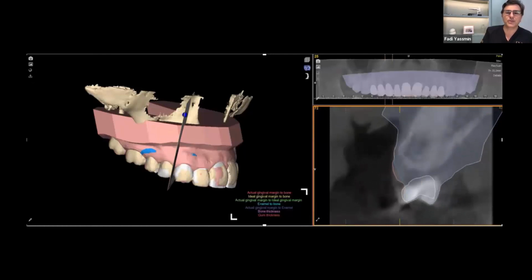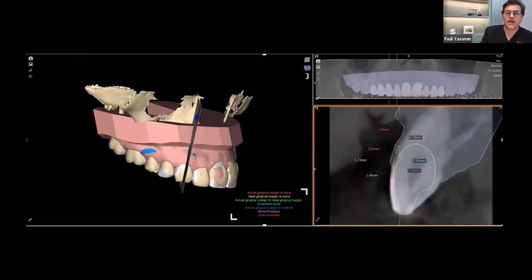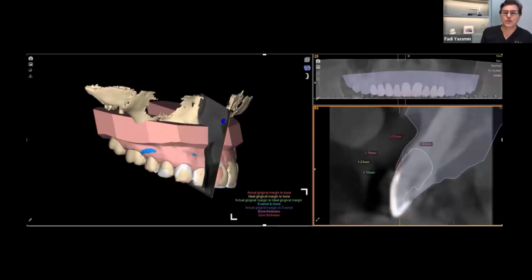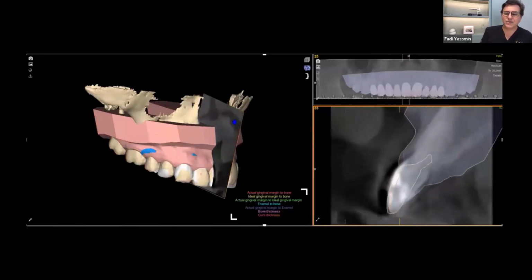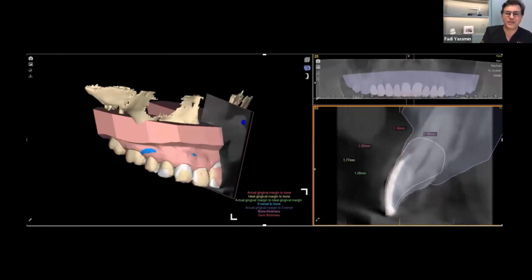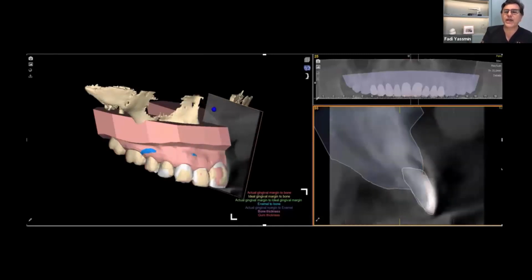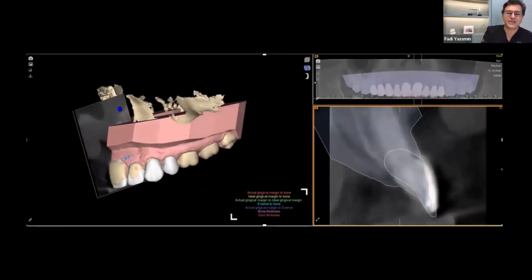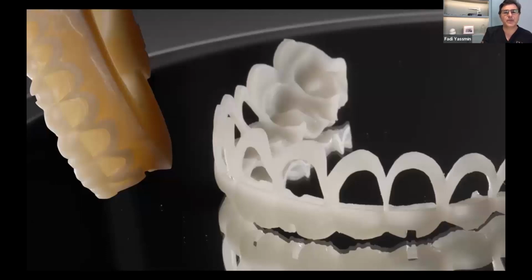And this is what's really important. Because you have a design, we need the final outcome, but we also need to have tools that we can print and use during the surgery. My periodontal analysis is based on where I want to finish the final veneer that is facially driven. And what I've been using lately, and it's a godsend in terms of crown lengthening surgery, and I'm talking not only soft tissue, but also the osseous component.